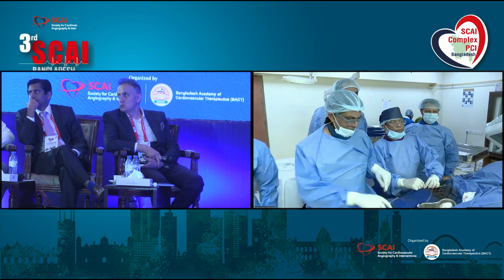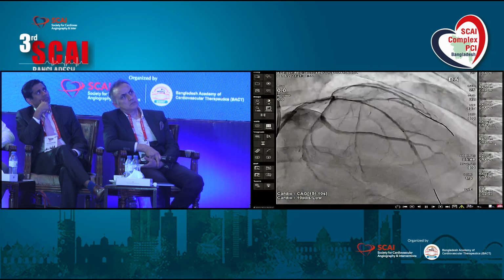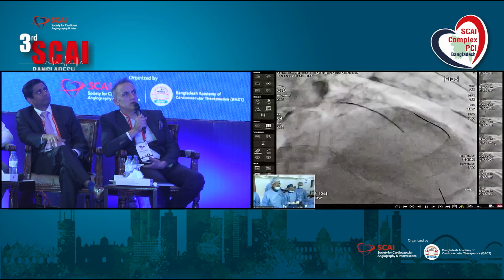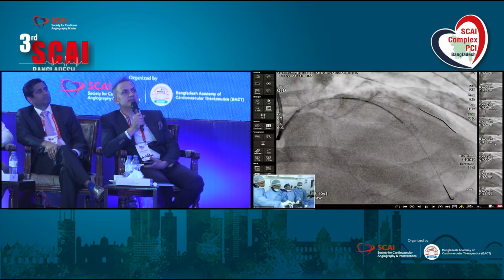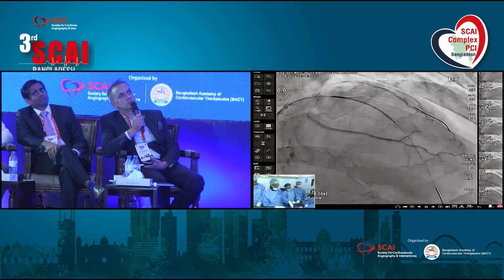Do you want to check? Is there any lesion just proximal to the CTO segment, just before the diagonal? Yes, we are also covering that segment? Looks good now. Maybe come back. What is the size of this stent? Approximately there is another part. I would like to cover that plaque also. Okay. So what is the size of this stent and which type of stent? 3 into 38. Okay. I think it's all right.